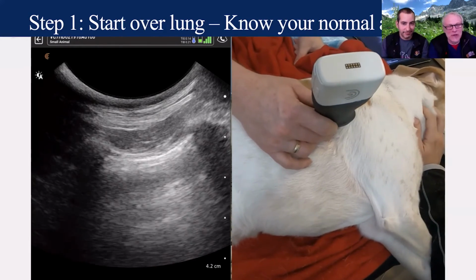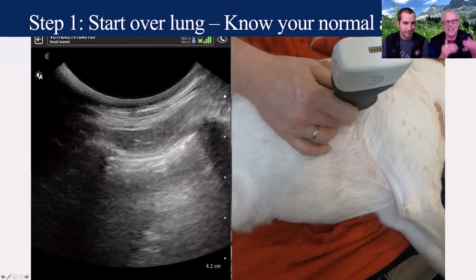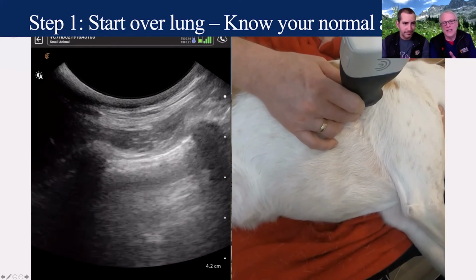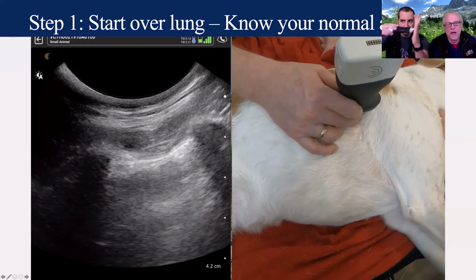Once again, Dr. Chalhoub, we'll call it the dead bat sign, but you can change the angle of inclination. The idea is to make that pleural line less bright white, make it grainier by decreasing your gain, by changing your angle of inclination, or sitting over one rib. The grainier it is, the easier it is to see the lung sliding or the glide sign. I like that. So again, no guesswork, Dr. Boysen. So we started at the cranial border. Now we're going to move backwards until we hit the caudal border, which is called the curtain sign, Dr. Boysen.